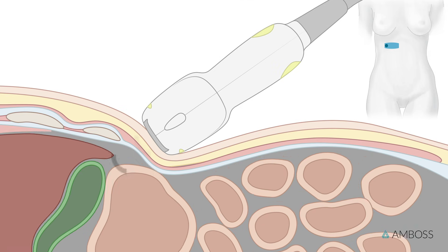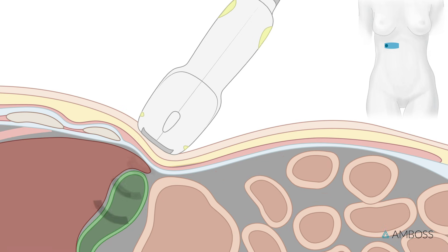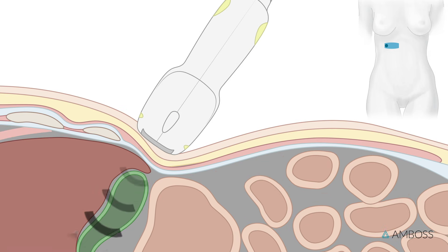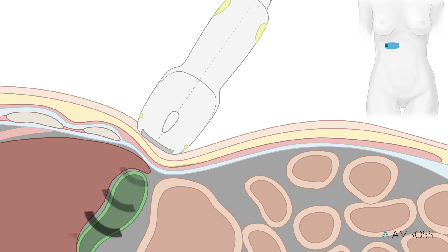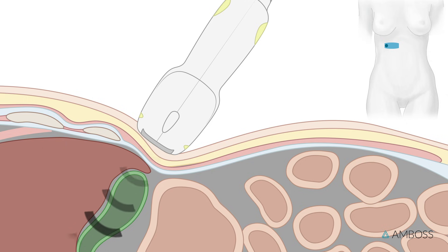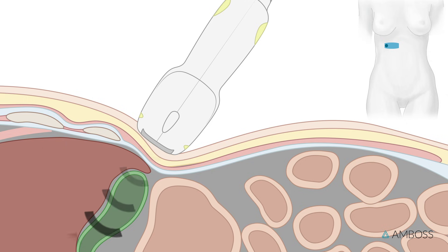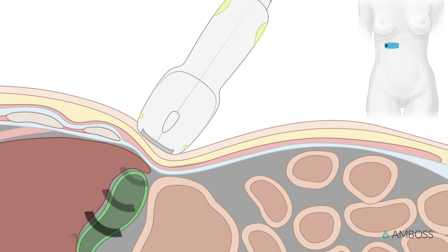The patient should be instructed to inhale deeply. Doing this shifts the liver, and with it the gallbladder, in a caudal direction. This allows us to use the liver as an acoustic window.